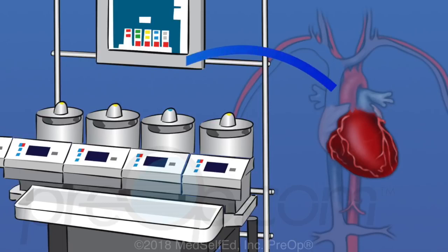While the heart is stopped, a special pump called a heart-lung machine keeps blood oxygenated and flowing through the body. Blood is carried from the body through tubing to a machine where it is mixed with oxygen, then pumped back to the body. After all of the grafts have been placed, the heart is restarted and the pump is disconnected.